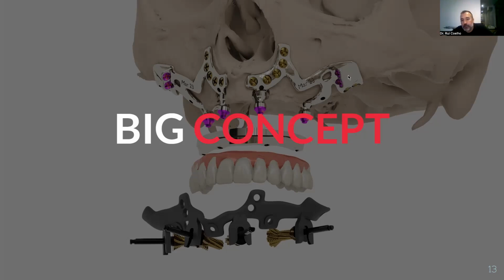Also, the screws that go inside the zygoma are screw locked. That means that they screw on the implant, making it rigid. For us, it's not a big problem for the screws that are perpendicular to the force, because they are inside a cone that is designed on the plate, so there is no micro movement. But these ones that are more or less parallel to the force tend to gain a gap. And this is very important.